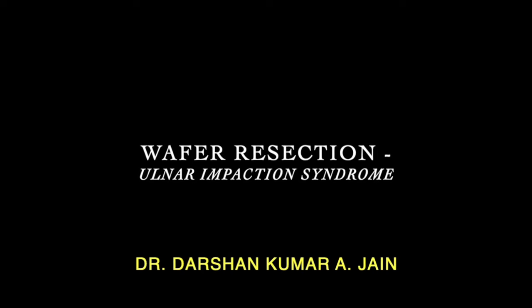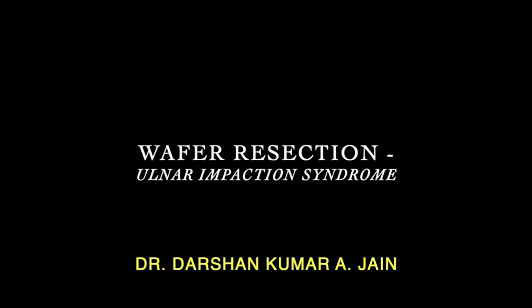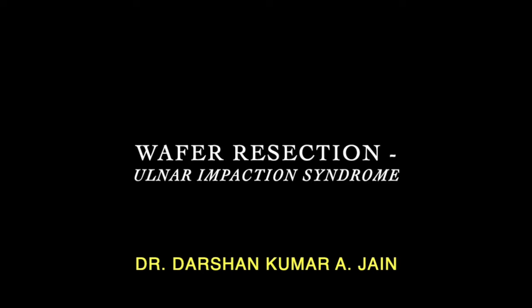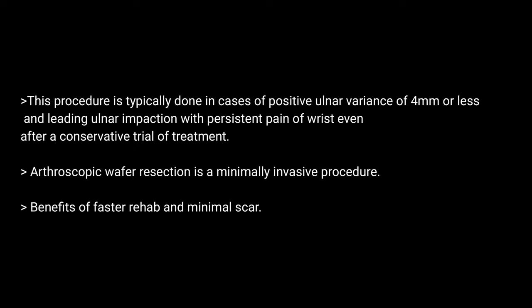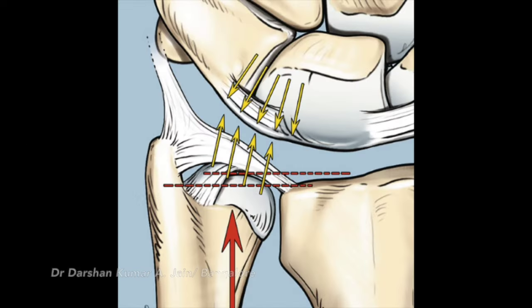This video shows the wafer resection due to the ulnar impaction syndrome, which is essentially a positive ulnar variance of 4 mm or less secondary to a wrist injury.